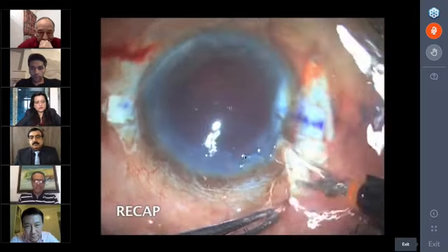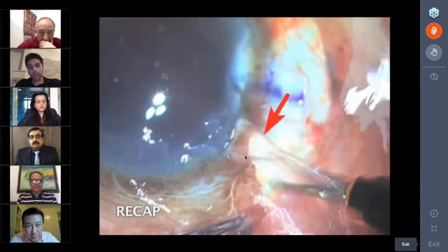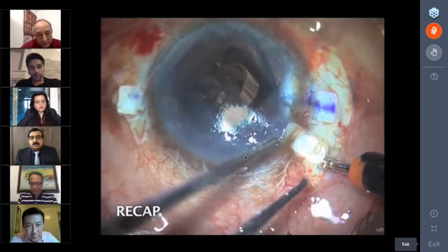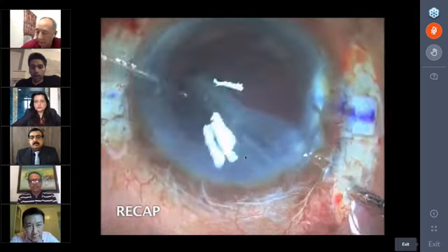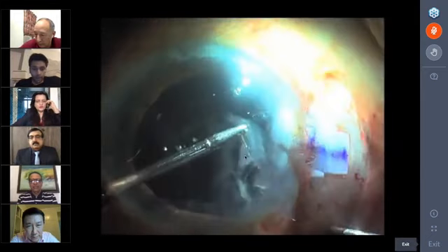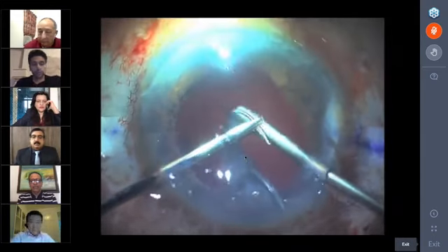Watch this. I'm putting my trocar in, but at the end, what's happening is infusion is actually coming out. Fluid is coming out of the main port wound or the side port wound which I had created. And that is allowing a convection current inside the eye. That's how, because it's already a vitrectomized eye now, it allowed my intraocular lens to come back into space. Now I'm grabbing this with dear hands and with kid gloves to ensure nothing happens at this point of time.